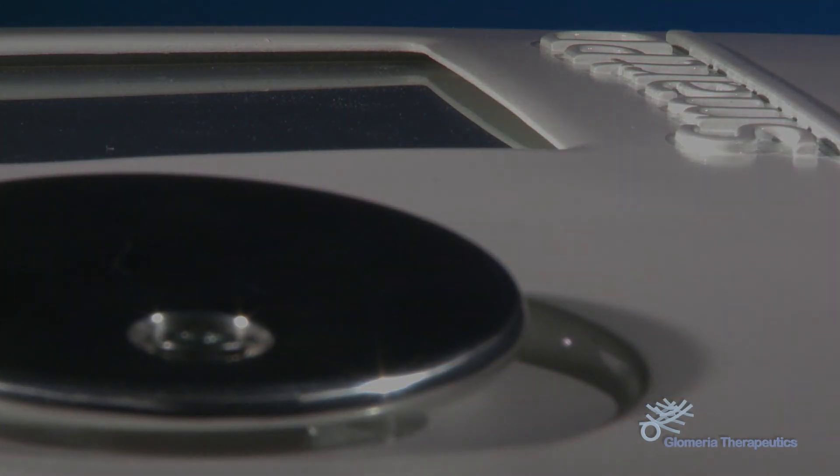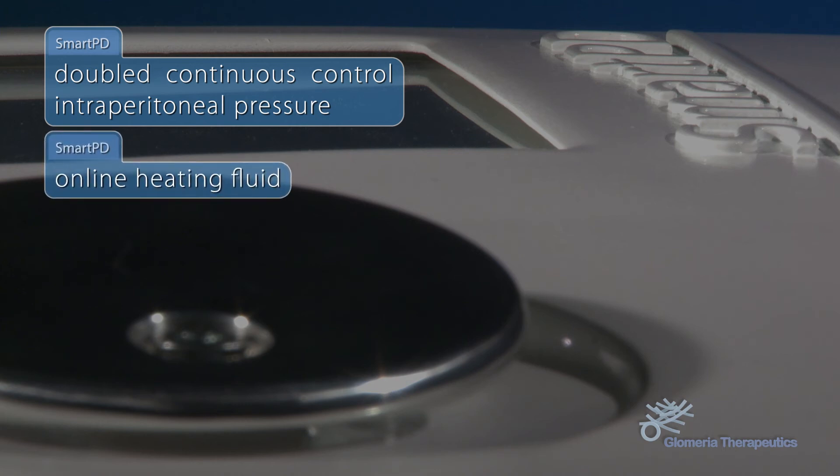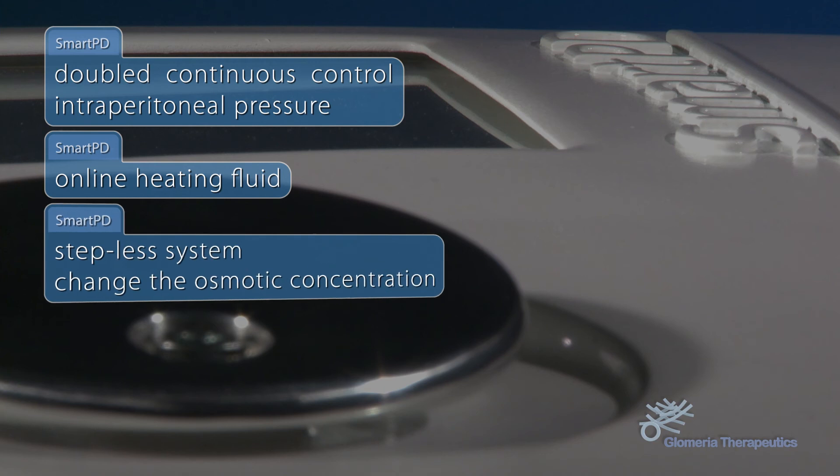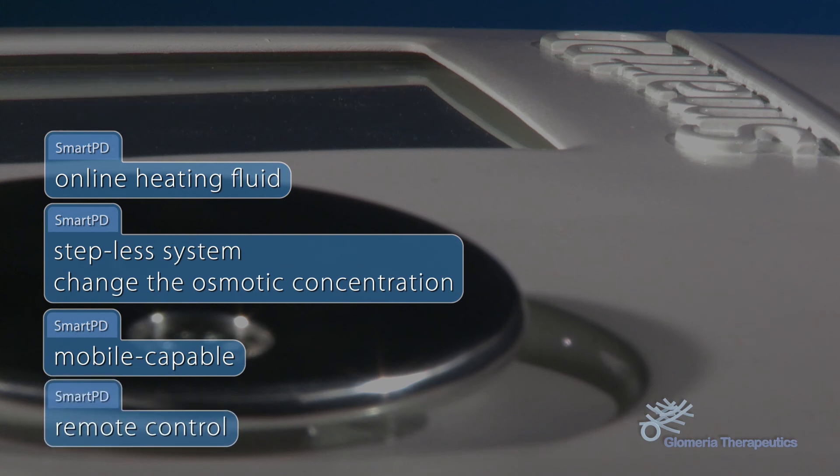Glomeria's SmartPD provides doubled continuous control of intraperitoneal pressure, online heating of the dialytic fluid, an innovative stepless system to change the osmotic concentration of the incoming peritoneal solution, and a refined mobile capable remote control of the cycler.